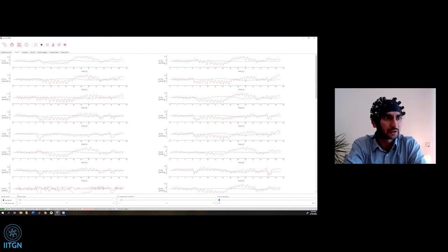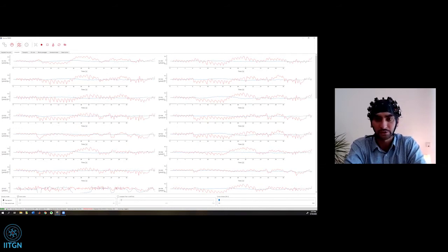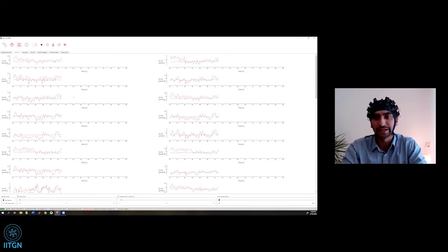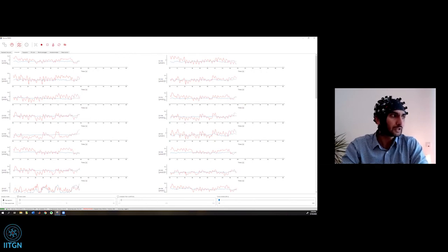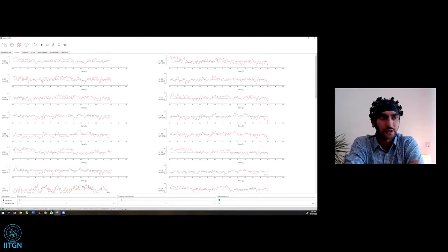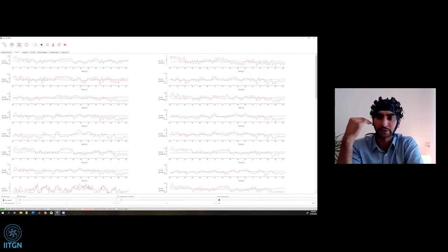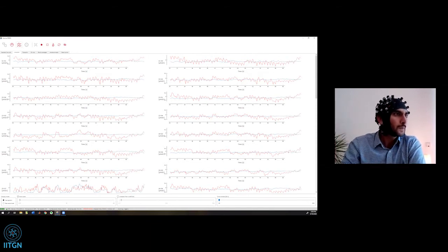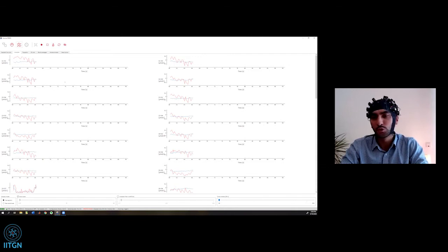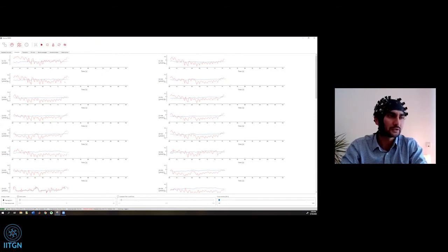What you see on the screen in color red is oxyhemoglobin, so how much hemoglobin has oxygen. That is an indication of brain activation, actually. In the blue, you see deoxyhemoglobin, how much hemoglobin is lacking in oxygen. And right now, as I'm talking, these nice sinusoids you see are my heart rate. That's an indication of how good the contact is, how good the sources and detectors are in contact with the skin. So it was a few minutes. During an experiment, I will spend a few more minutes just to make sure that all the optodes are rightly set up, but it doesn't take too long.